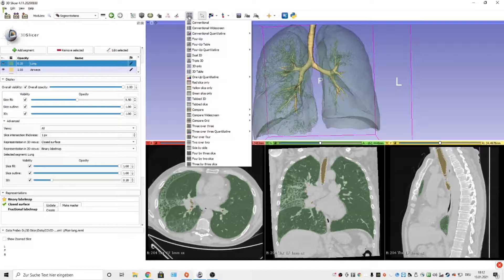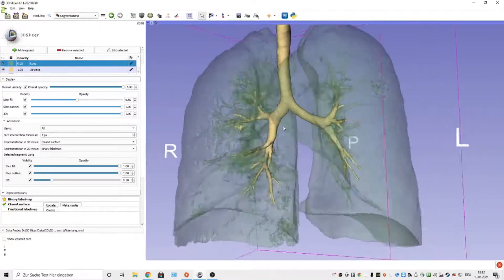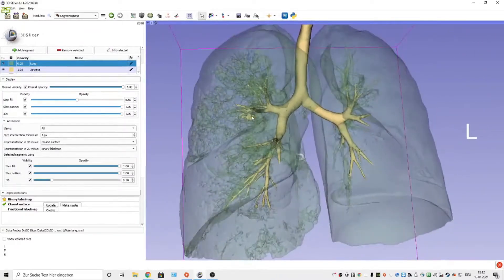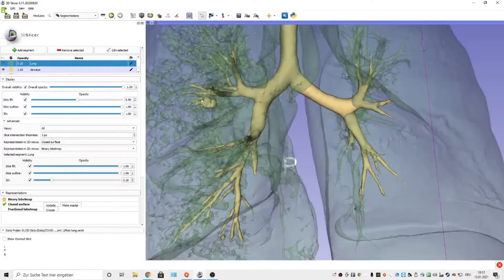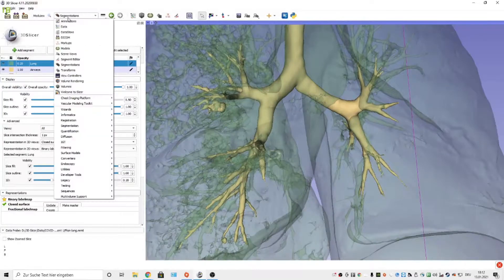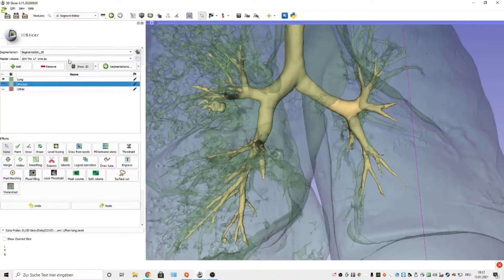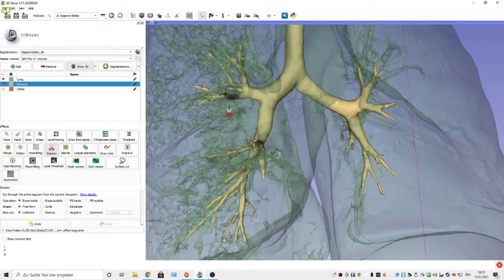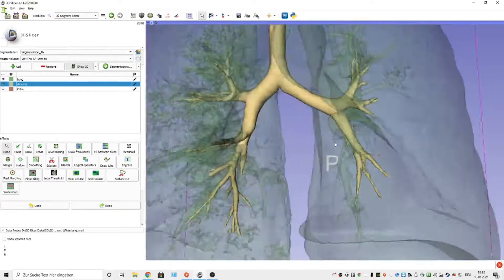Let's go to the 3D view only. You can see that we've got a little problem here — a small leak. I'll show you how to correct this. You go to Segment Editor, select Airways, and select the Scissor tool, then cut out the leak. Don't forget to go back to None, otherwise you will cut around in the segmentation.